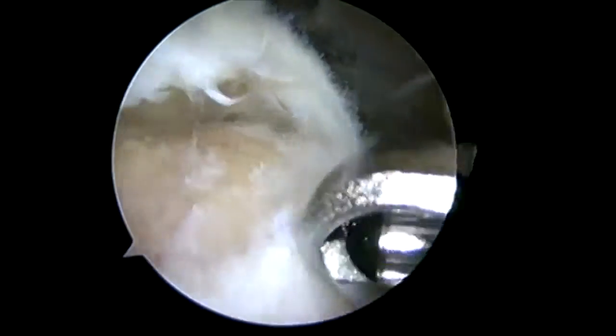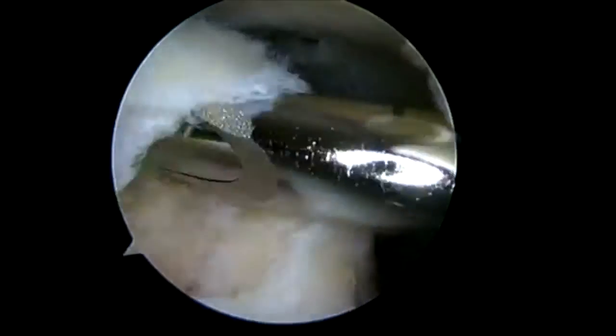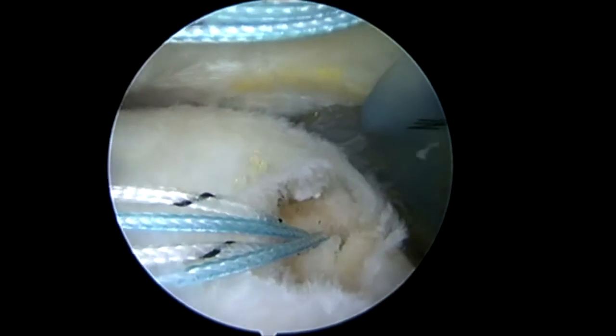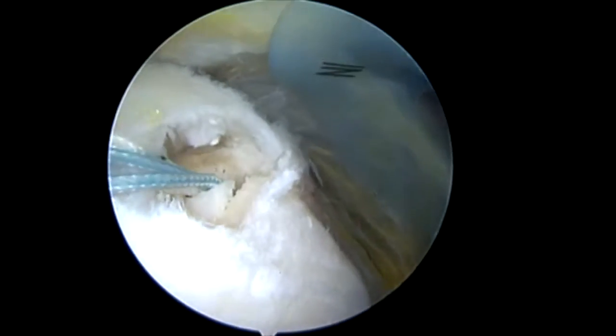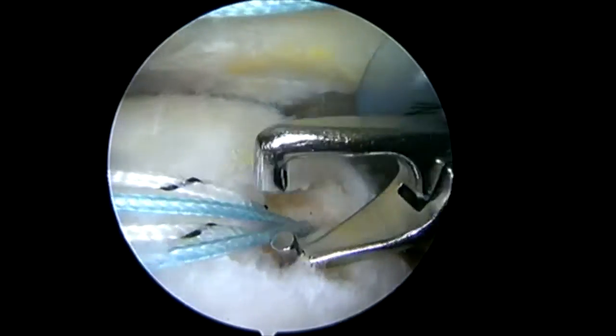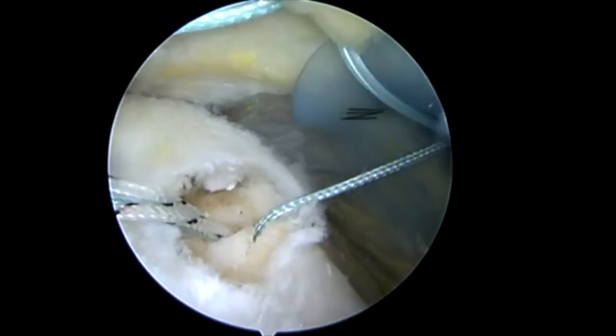We want to make sure that we have a good angle. You can see that I can quickly access the lateral aspect of the humerus here. I've cleared out all my bursal adhesions, and also cleared out any spurring to ease the access into the joint. I'm going to go ahead and pass my sutures and tie these down.